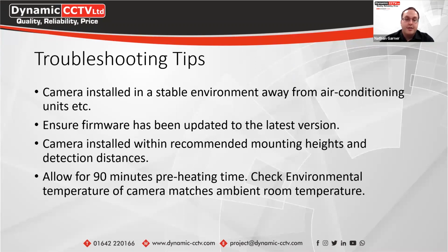You also need to check that the environmental temperature of the camera matches the overall ambient room temperature. You can check with a thermometer in the room and make sure that the camera is reading that as the environmental temperature to ensure the accuracy.